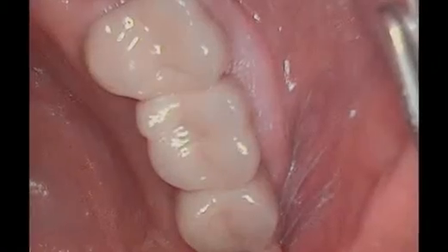We just finished our bridge using the CEREC Connect technology. It was a good experience. I was amazed at the fit of the restoration. And then, it dawned on me that for the first time we actually made a bridge to the teeth rather than to a model of the teeth. I had virtually no adjustment to the bridge.